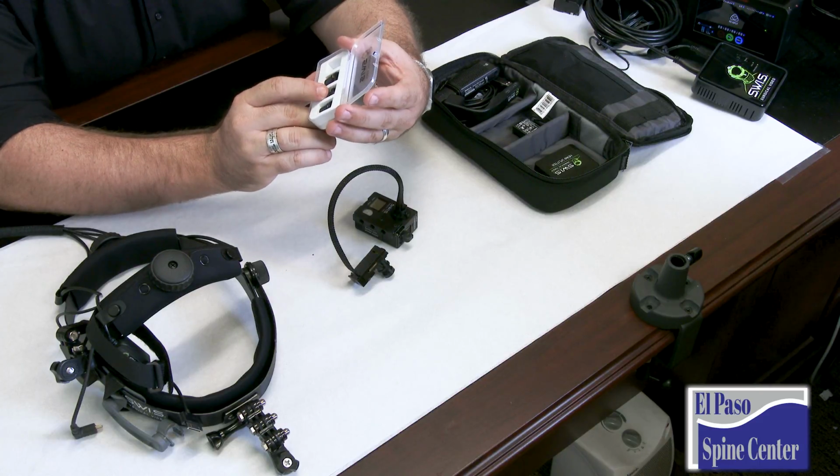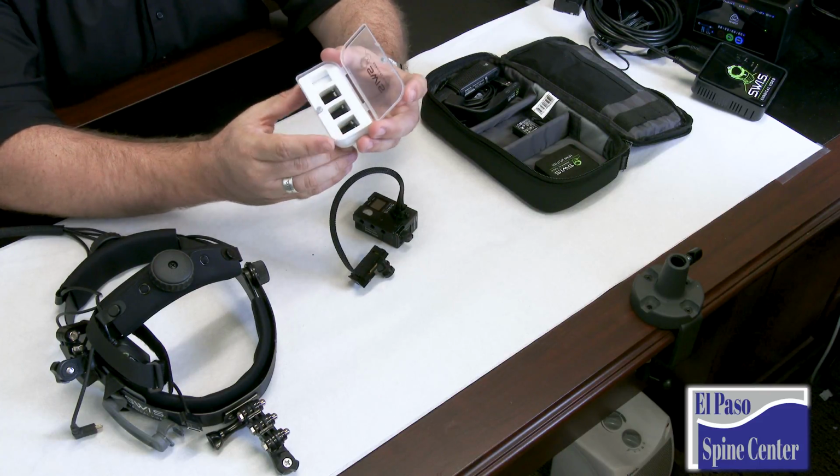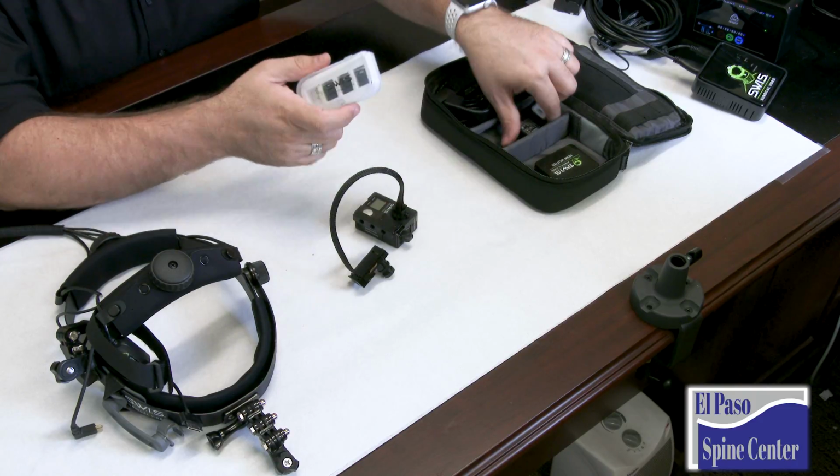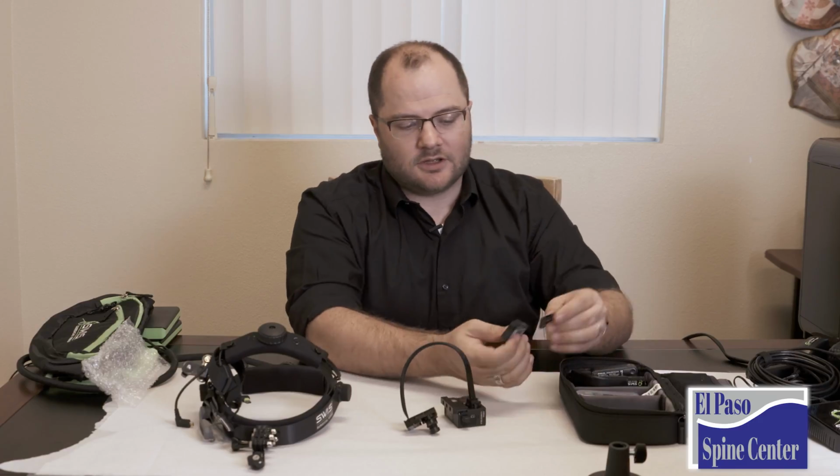1.5 times, one is a 2 times magnification, one is a 3 times magnification, just to get closer into the shot if you want. You can play around with those. A couple of other pieces.